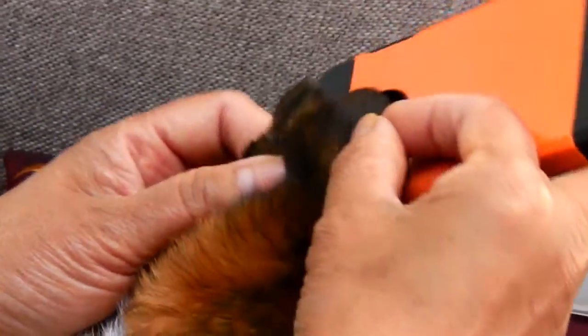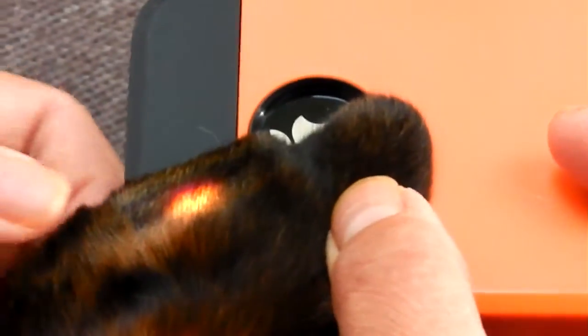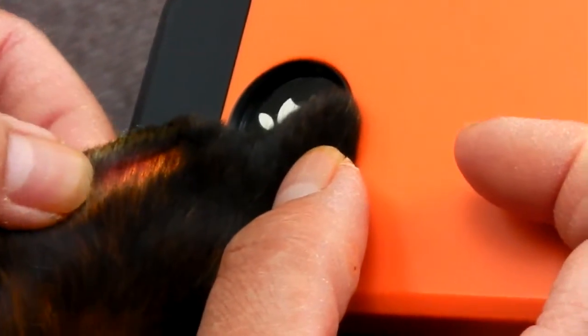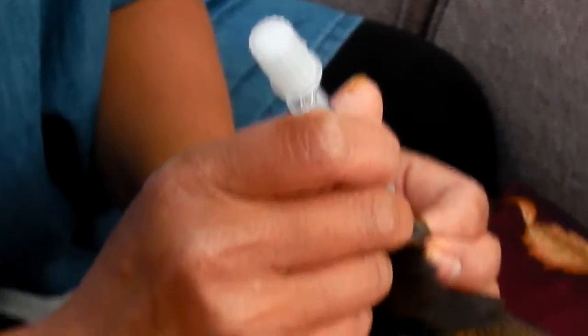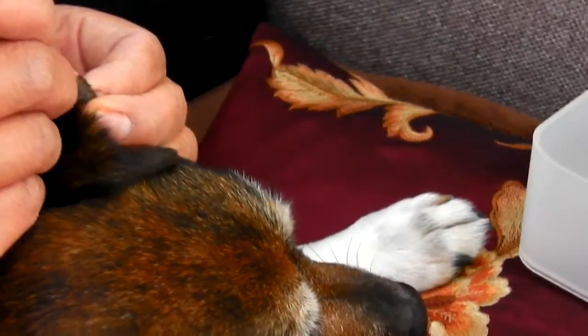Can you hold one second, honey? There — the vein, tiny vein. Put my finger where I need to. Leave my finger right there. Okay, let's see. You'll feel a bit of a prick — she's used to this.